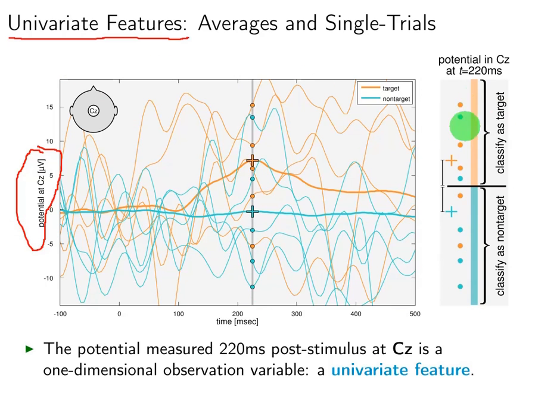Now, given these univariate features, we can observe here that some of the amplitude values collected from ERPs appear to be on the other side. For example, look at this blue point, which is supposed to be on this side, right?